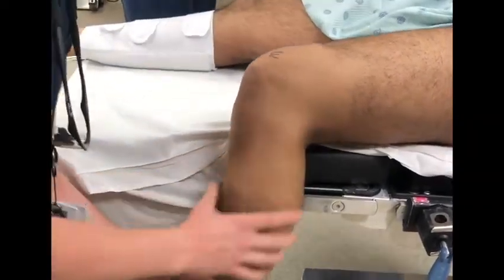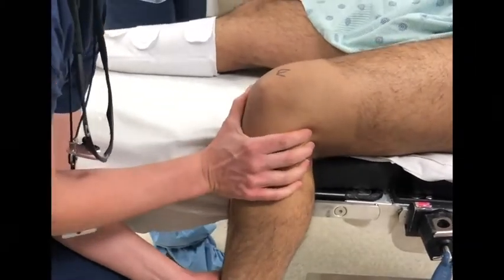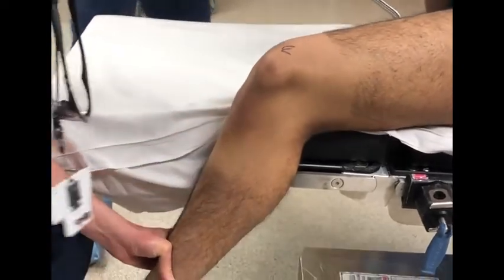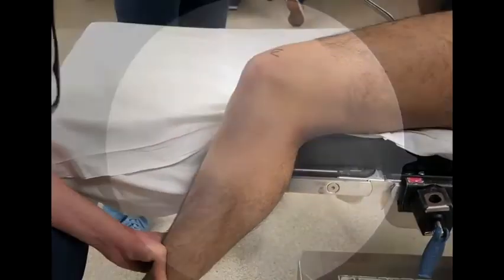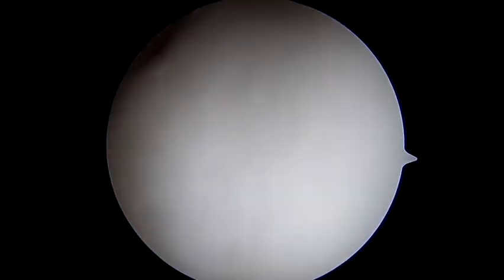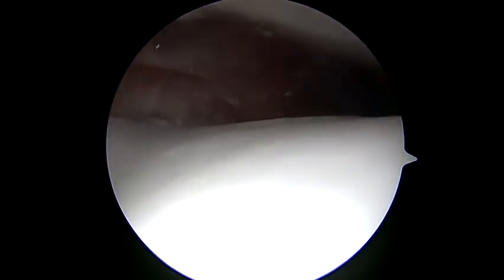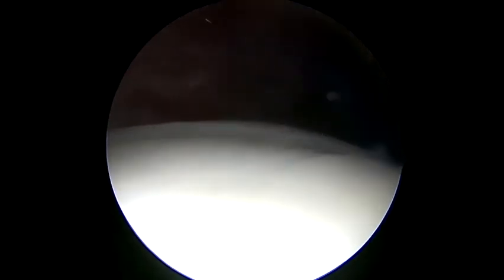If we move the knee into flexion and try to dislocate laterally at 90 degrees, this is not possible, but the kneecap does come out at about 70 degrees, demonstrating his significant dysplasia. Arthroscopic examination starting at the notch moving proximal demonstrates the trochlear dysplasia as well as the supratrochlear spur present at the most proximal aspect of the trochlea.